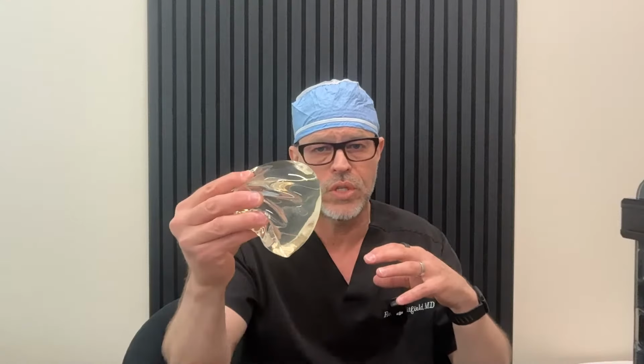And the other is, if any of that particulate matter comes off of the shell of the implant capsule itself, the actual surface of the implant, then that can stimulate an immune response, because each of our T cells has a little receptor, and it's going to recognize something that's foreign. And so if we left all that in our tissues, it's just reacting to it. And then there's been a recent paper published about that interaction being more like a transplanted organ that's being rejected.